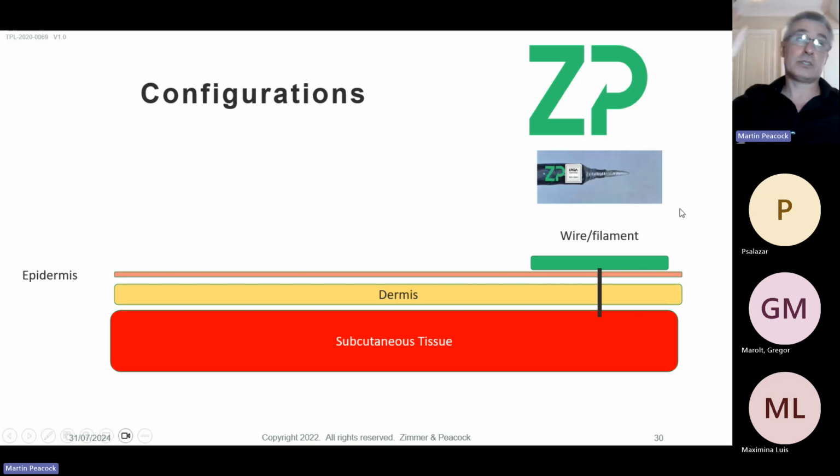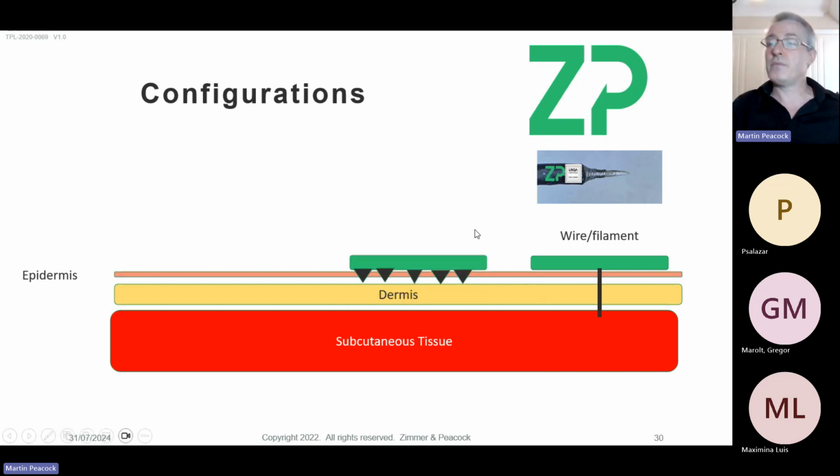Now, when I say state of the art, I think one of the original papers on this was actually published in 1992. I forget his name for a second. George Wilson, sorry, 1992, probably first published a paper on this. And the paper that he published is amazingly similar to what Dexcom actually have. Now it's becoming microneedles.